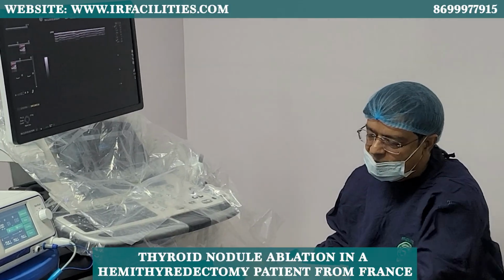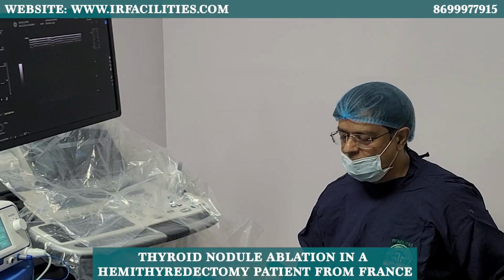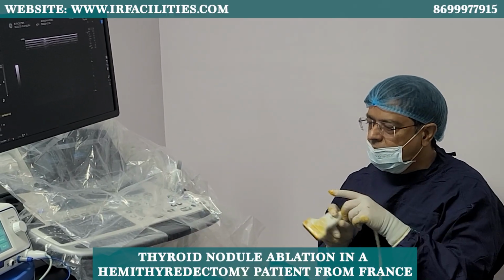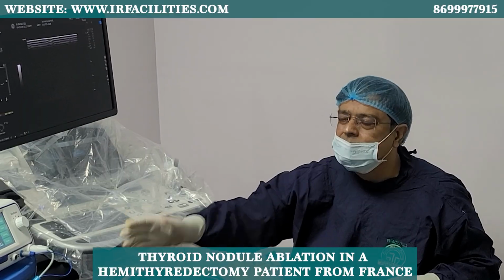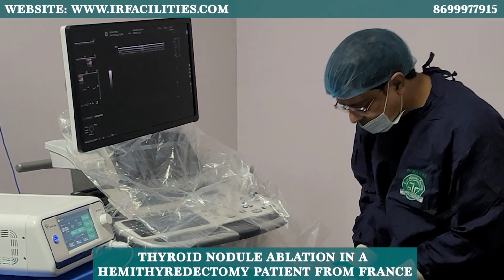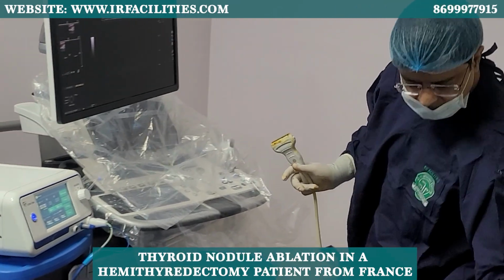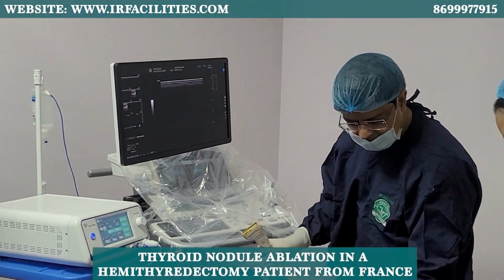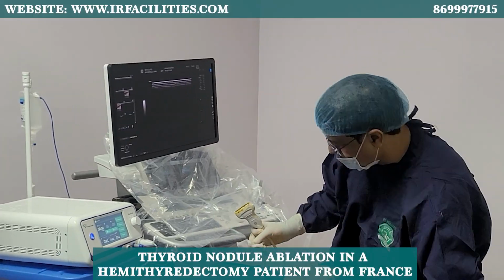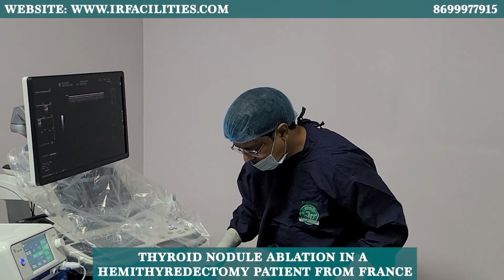Somehow this was growing into the chest from here. So I'll remove that part also. That was completed. Ask her. She's okay. So I can wake up. You can't wake up without me doing certain changes. Okay. Now you can get up and I'll put the pillow here.